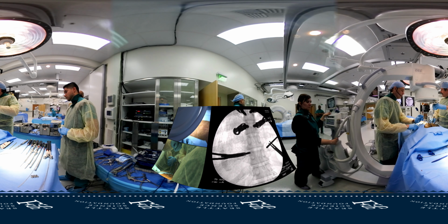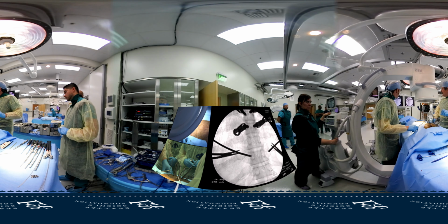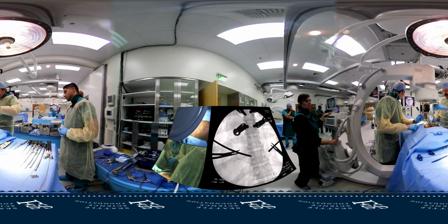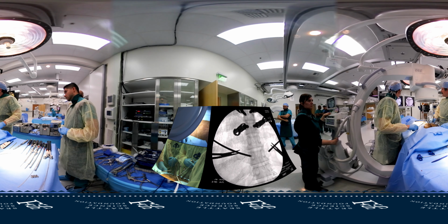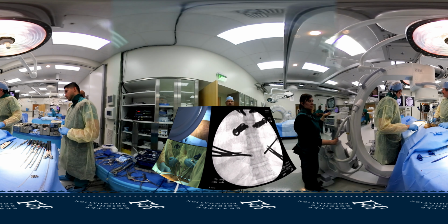On my side, I'm going to try to hit 3 o'clock, and Andrew's going to hit 9 o'clock. So Andrew's almost perfect there. If you have navigation, this can be done nicely under some of the navigation systems.